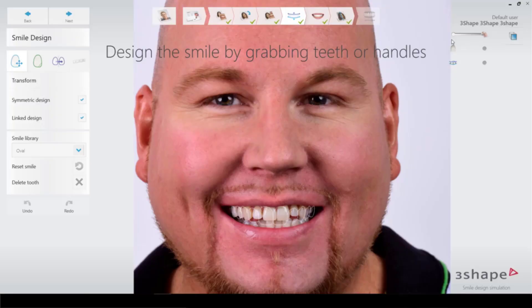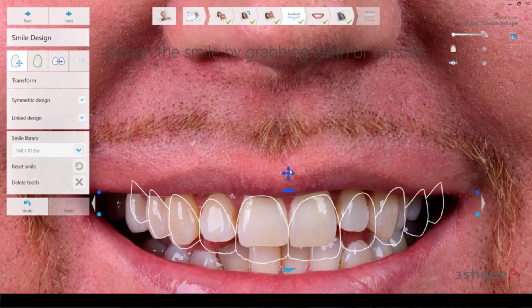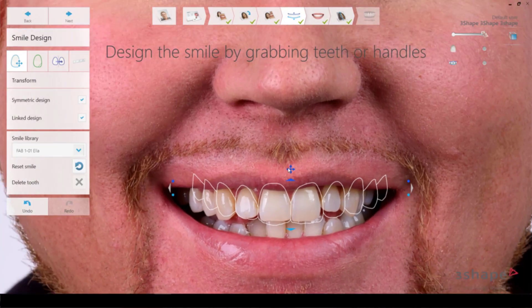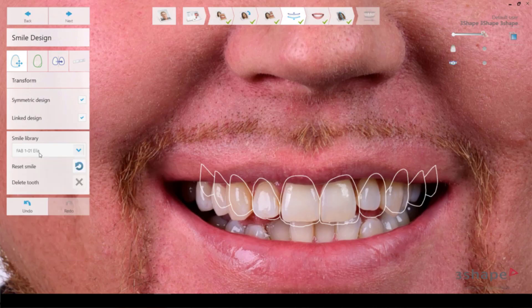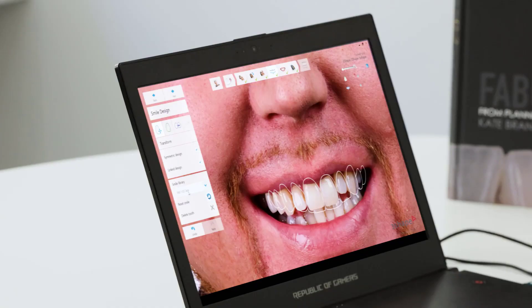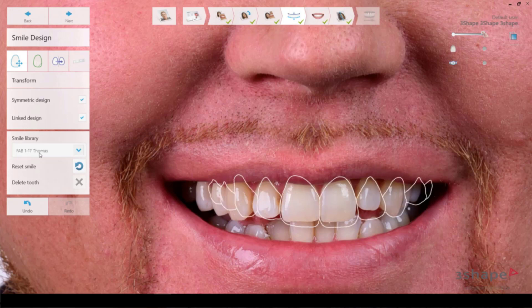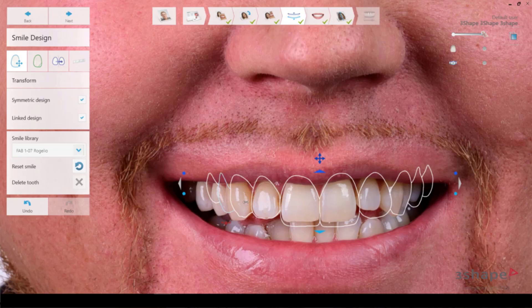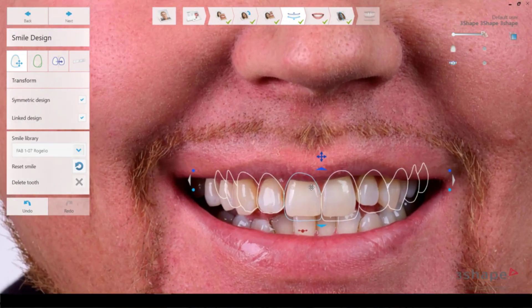We can remove those lines if we want to, and switch between the retracted photo and the full face photo. Basically what I'm doing is checking for a library that fits the patient. Normally with the Fabulous Smiles book, you can let the patient look through and see if they find a smile they really like. We have 18 nice libraries here — all natural, all asymmetric — and you will see a lot of asymmetry, and that's on purpose.